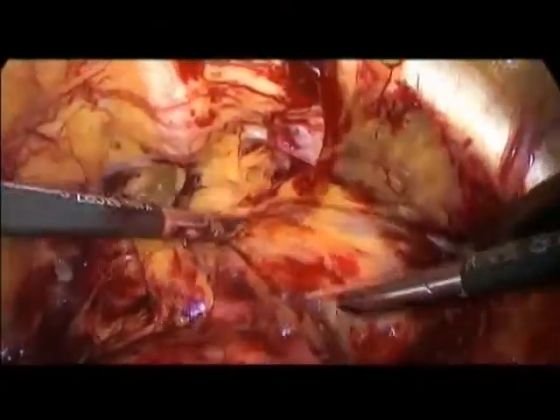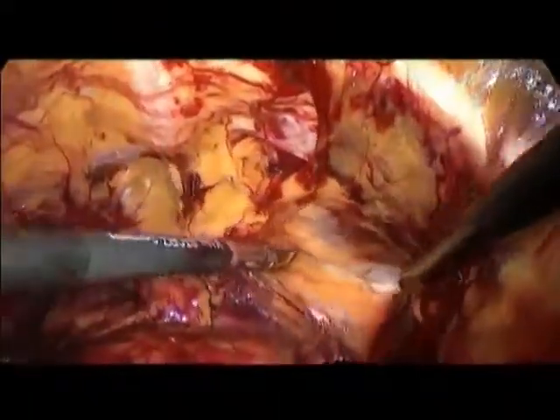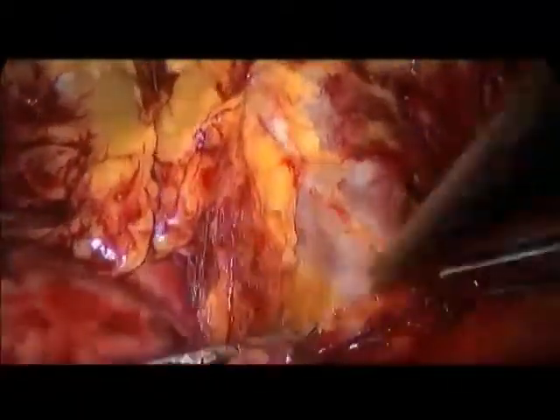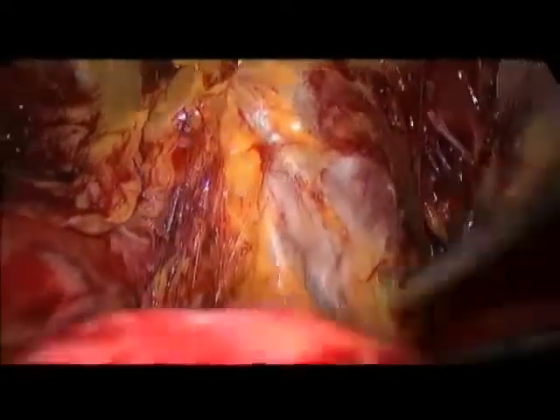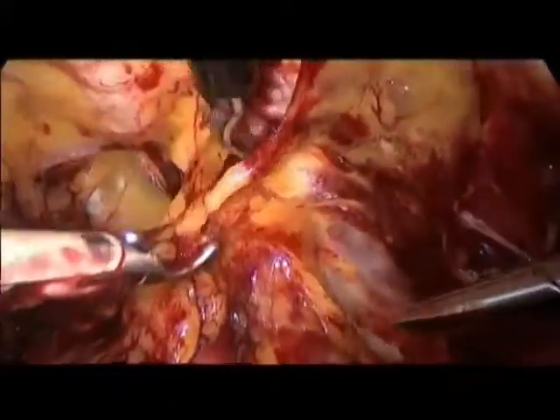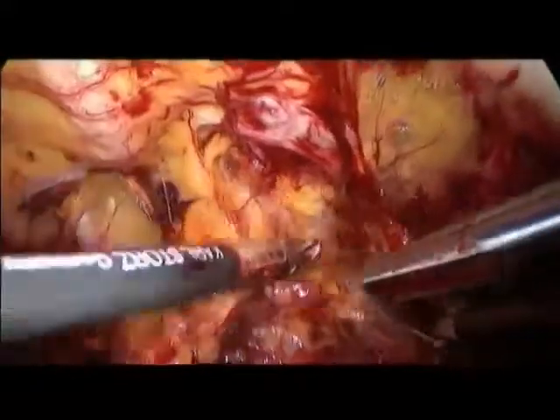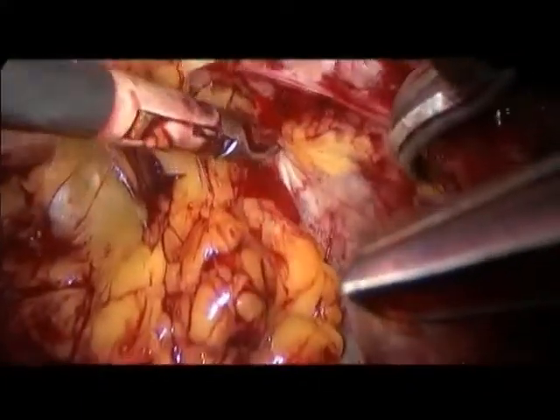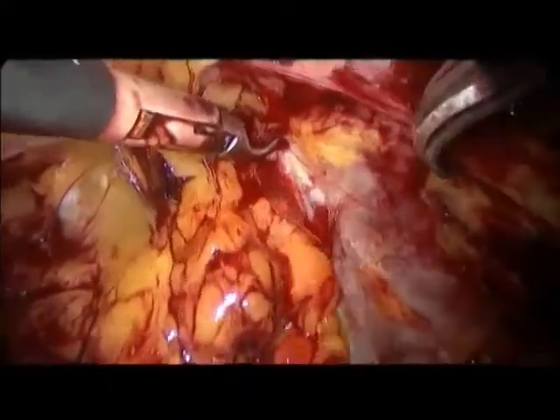Now there is a time devoted to developing the Retzius space and defatting the anterior aspect of the prostate and of the bladder. This can be time consuming in some patients, but this is true for any approach. And it's certainly not specific to this dissection of the peritoneum.